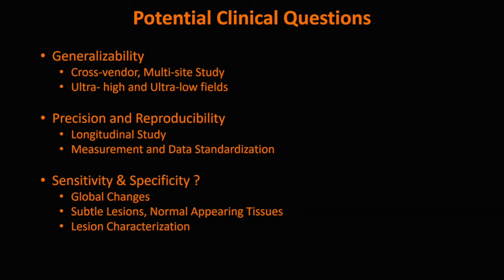For the robustness, this quantitative scan can be applied in ultra high field and ultra low fields. For the precision and reproducibility, if the precision in terms of the technical variation is well controlled, this quantitative scan may be used for longitudinal study to monitor the treatment response and predict the outcome.